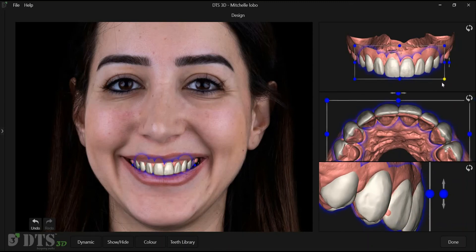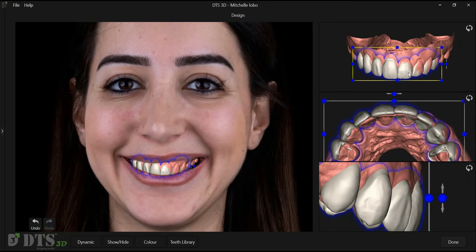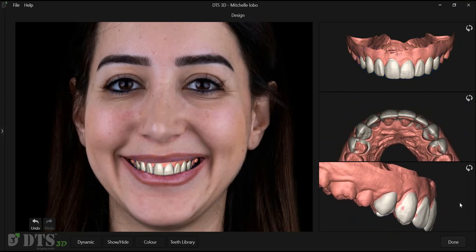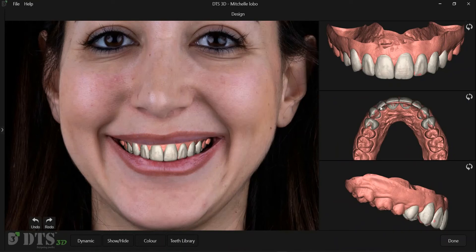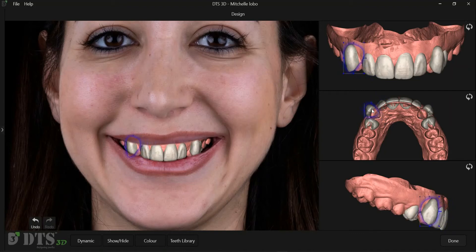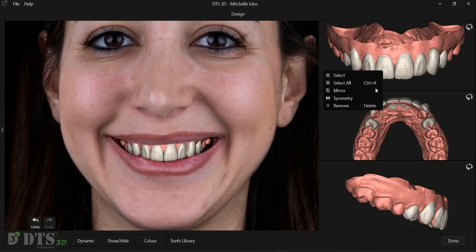The Smart Design screen is optimized for simple and quick 3D positioning of teeth shells. The Symmetry option carries out similar tooth movements on either side. The Mirror function creates a mirror image of the design.